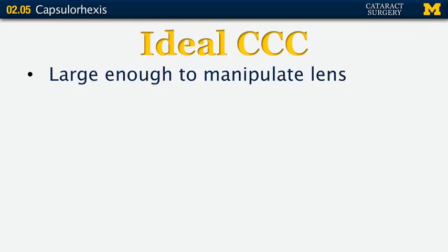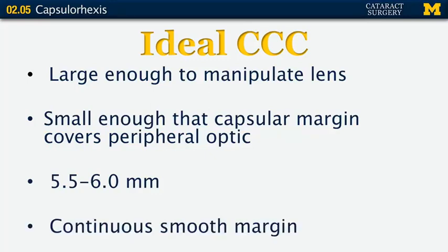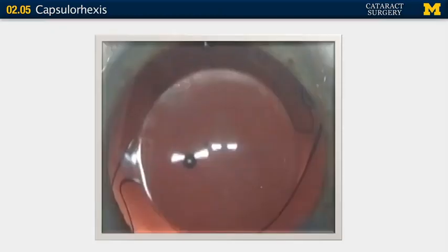It should also be large enough to manipulate a toric lens if you need to rotate it afterwards. It's small enough that the anterior capsular margin just covers the peripheral part of the optic — usually about half a millimeter — so it's typically around 5.5 to 6 millimeters. You want a continuous smooth margin to decrease the chance of tearing. The ideal opening shows overlap of the anterior capsule over the optic.